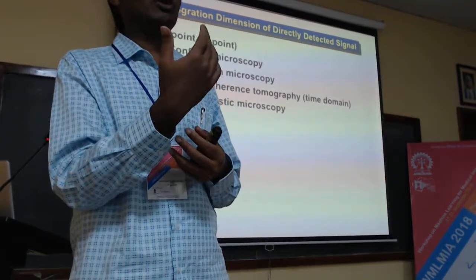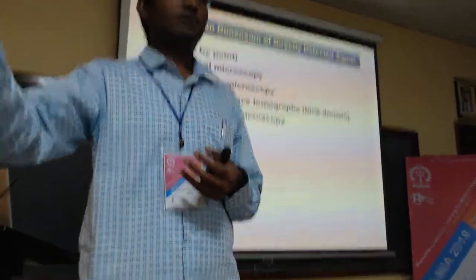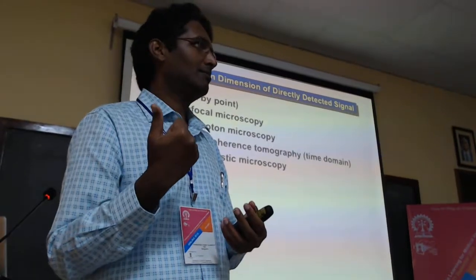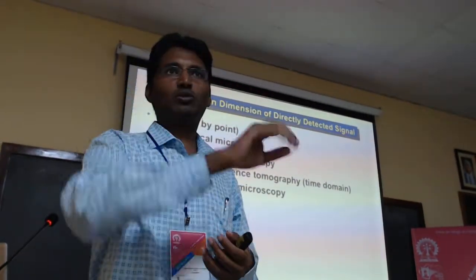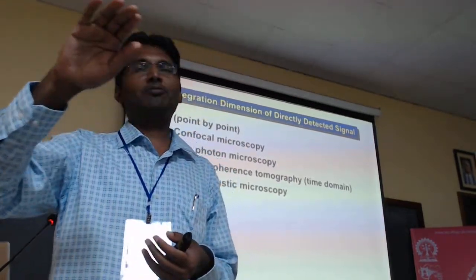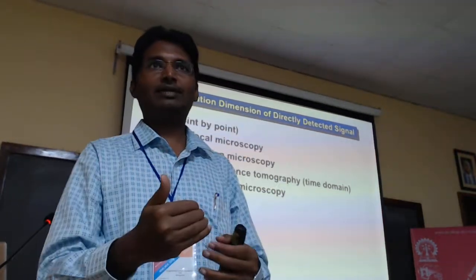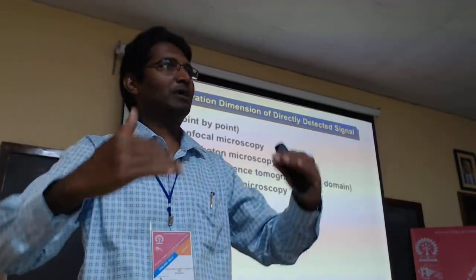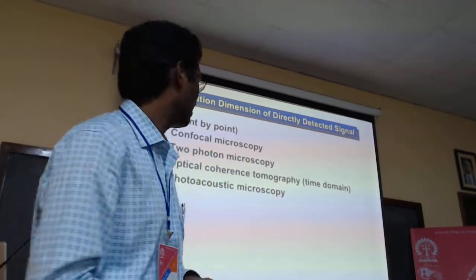Like ultrasound, like a B scan, we just put it line by line. All we do is get that signal, say this signal has come at a certain depth, so that depth is what we are going to form. That's going to form a line. And then when we get a time t plus delta t, that is going to form the next line, which is going to be below that. So we are just going to form this line by line by line. It's going to fill up depth wise, depending on the time.